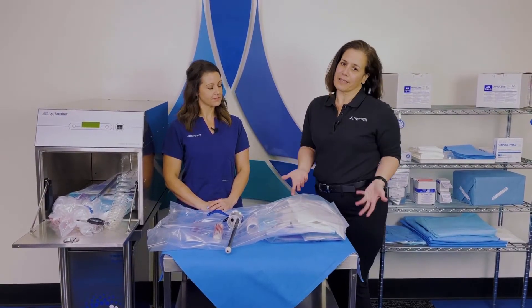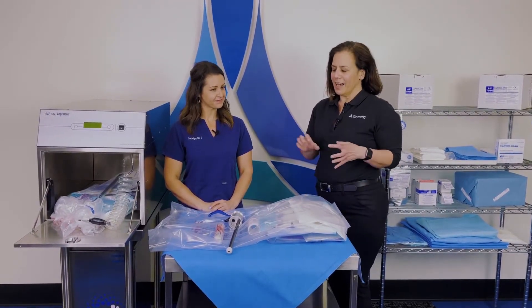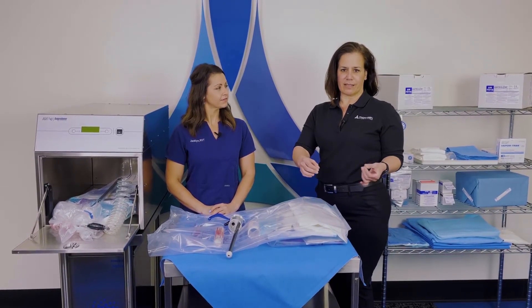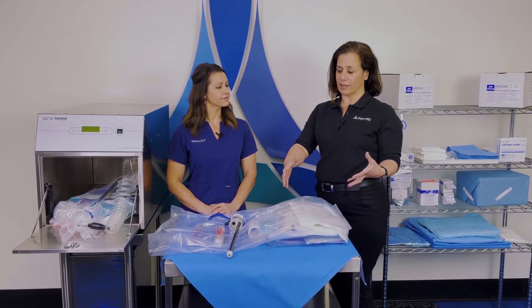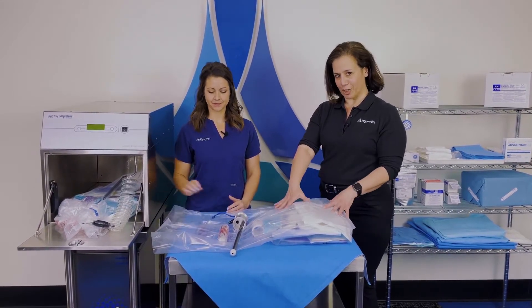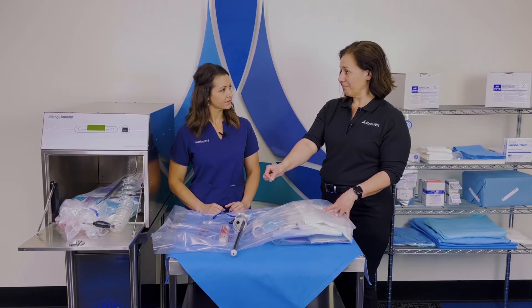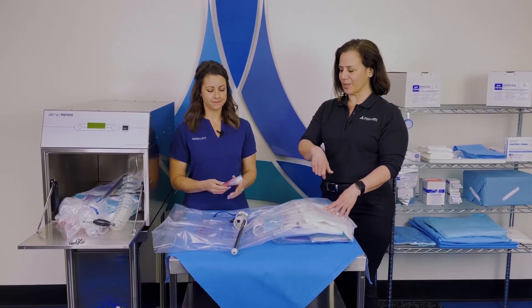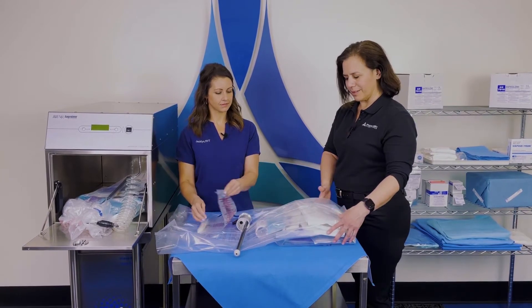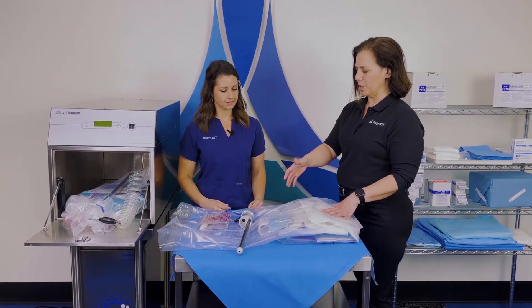That's a great topic and what I like to talk about quite often. With our systems, we are the only sterilization system on the market using EO gas and what we call a flexible chamber — a sterilization liner bag with the ampule that we discussed in one of our previous videos. All of your product goes into the sterilization liner bag with your gas ampule.